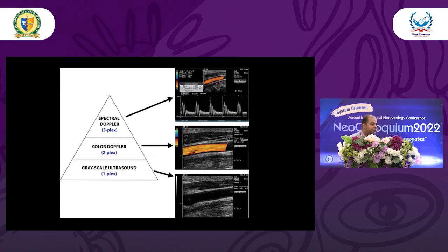Routinely, prescriptions पे आप लोग advise कर रहे होते हैं duplex scan and then a triplex scan. It's just how you go about. Only one quality, two qualities, and three qualities, duplex and triplex. Otherwise, you can easily say a color Doppler or a spectral Doppler.